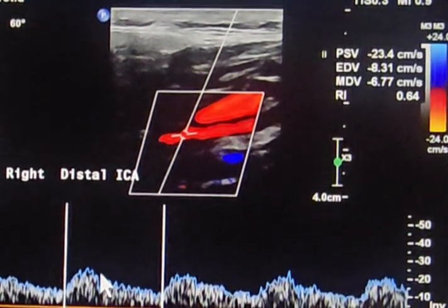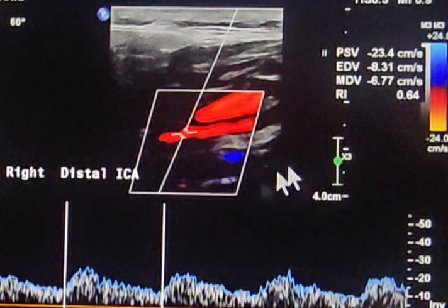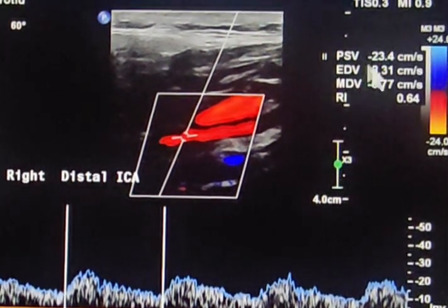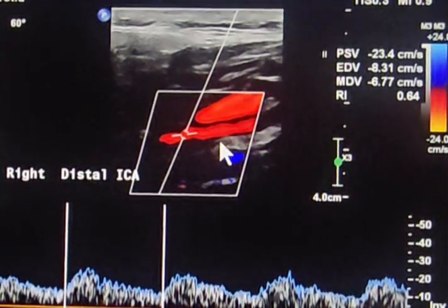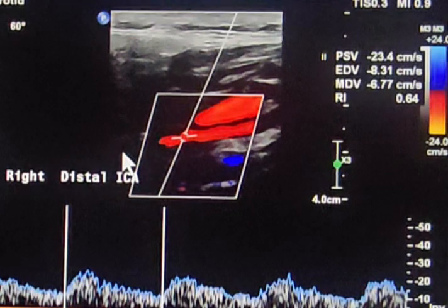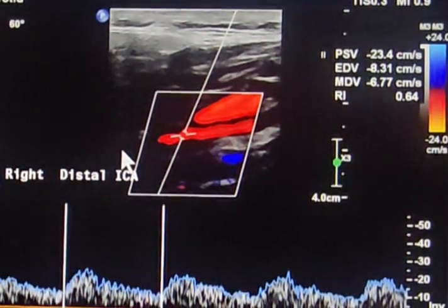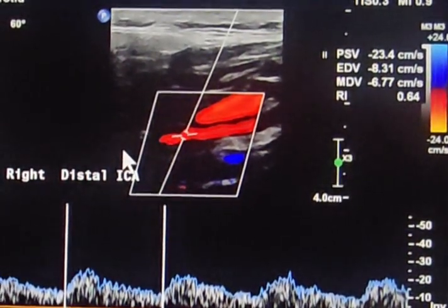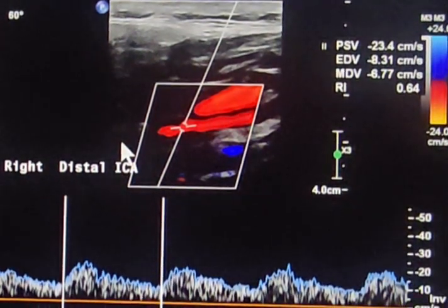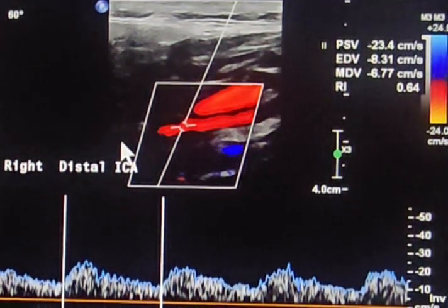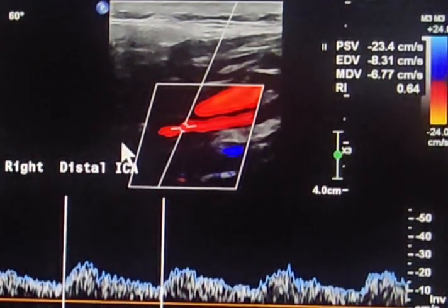As we move the sample gate distally at the internal carotid artery, we can see how the waveform shape has changed and the velocity is very low — it is 23 cm/s. This confirms that we have stenosis at the internal carotid artery lying between 70 to 99 percent, and it is almost toward the 99 percent.